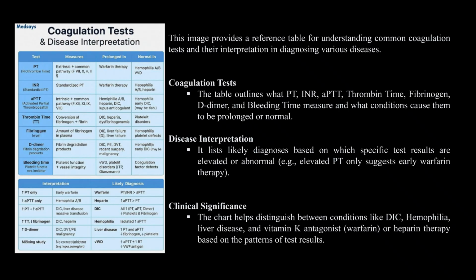The clinical significance is in helping to differentiate between liver disease, factor deficiencies like hemophilia, and anticoagulant medicine effects such as warfarin or heparin. The assessment also indicates life-threatening conditions like DIC, where rapid intervention is required.